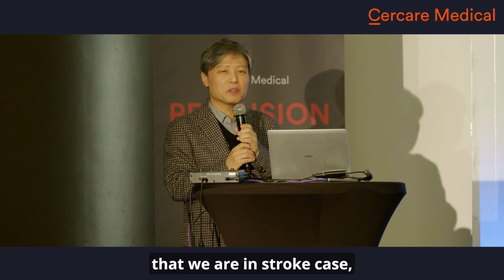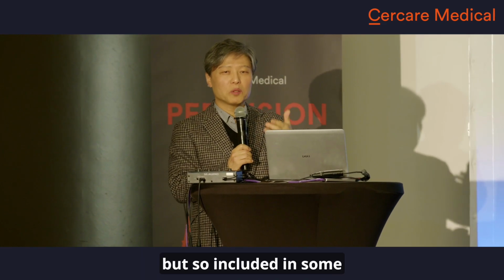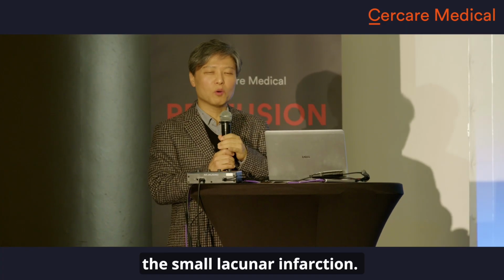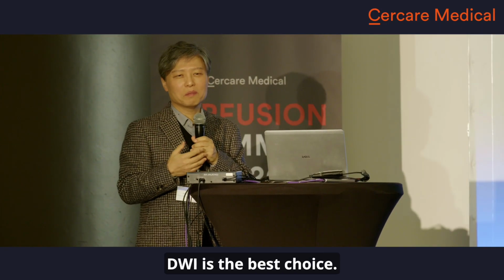In our stroke practice we routinely use CT perfusion, and some cases included lacunar lesions, but CTP doesn't detect small lacunar infarctions. So in that case, MR DWI is the best choice.